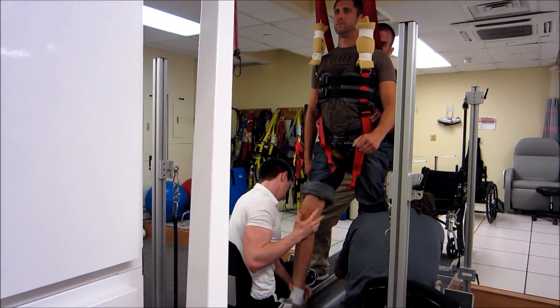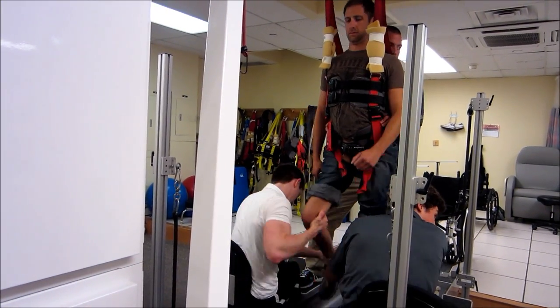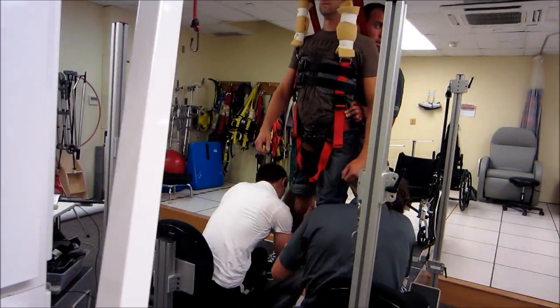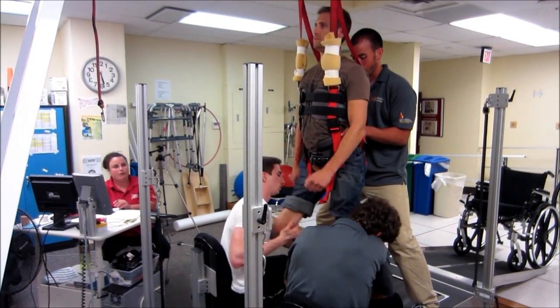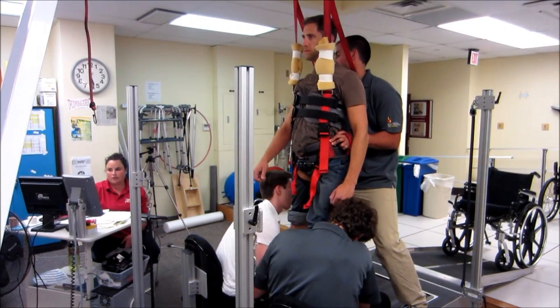I'm just going to let you keep going. You doing okay? Yeah. If you guys are okay with it, I'll just start slowing the speed down, but go straight into your step adapt. So we're going to slow down, Brian.